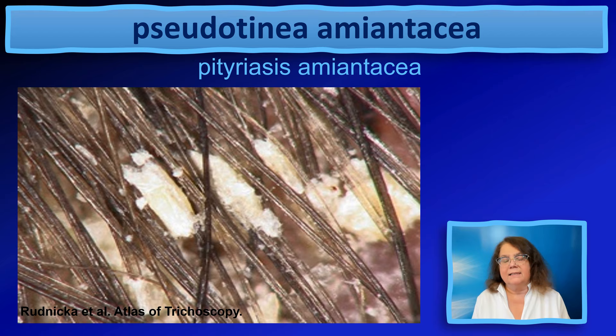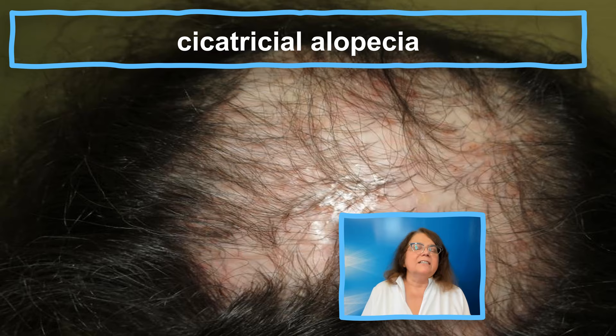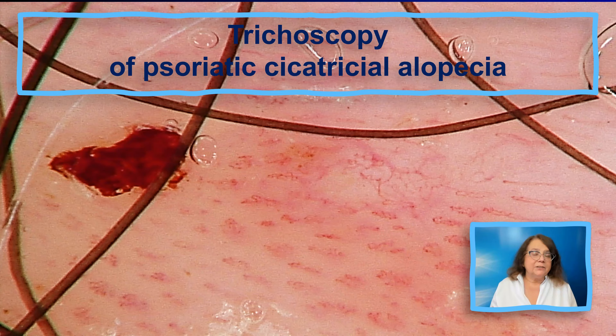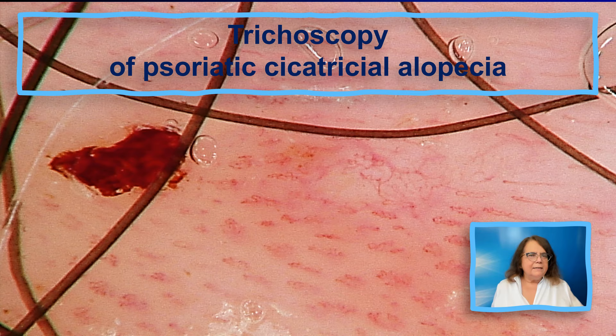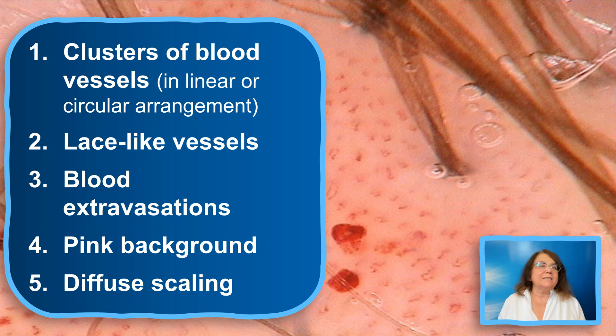This is a clinical image of cicatricial alopecia in the course of psoriasis — an image of psoriatic cicatricial alopecia. Trichoscopy in this case shows an area with no follicular openings and no dots, indicating that most probably there are no hair follicles. There are multiple blood vessels, partly arranged very regularly; in some parts these are lace-like blood vessels, and there is also an extravasation or possibly just a sign of mechanical scratch.